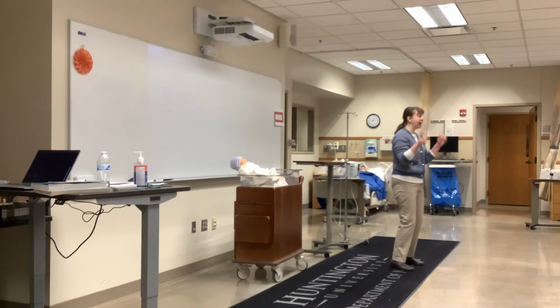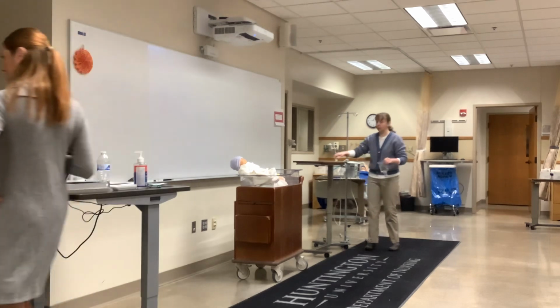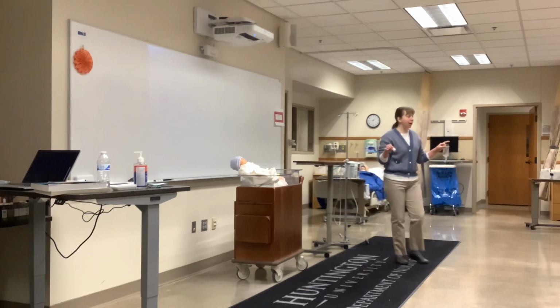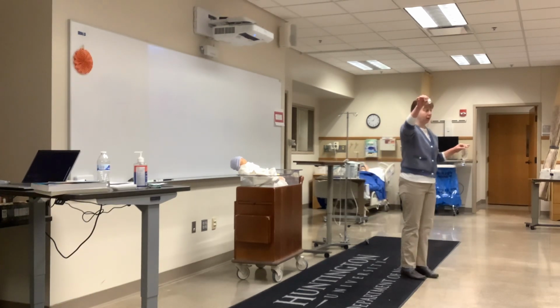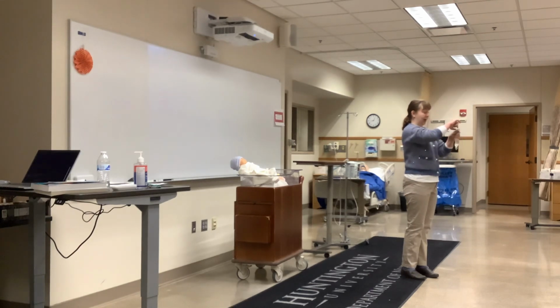Let's talk about that problem. Okay, so if I go into the Pyxis, for a reconstitution problem, I get my powder vial and I get my carrier fluid. This is my 250 normal saline, cool. Then I would take this off, pop this off, and per facility policy I might have to alcohol this off anyway, cool.